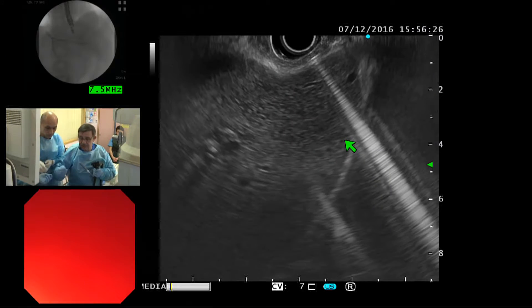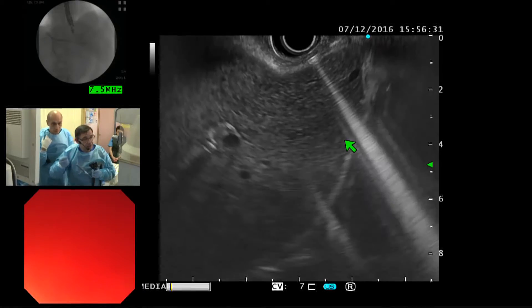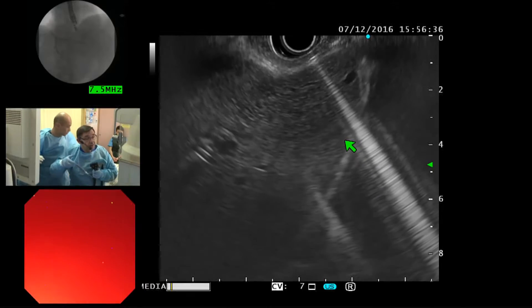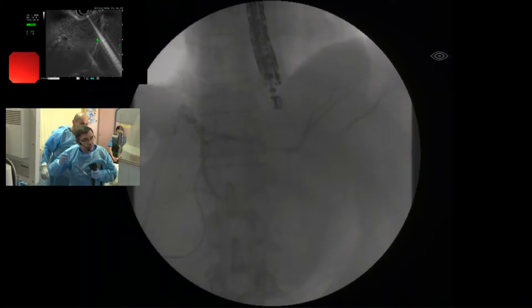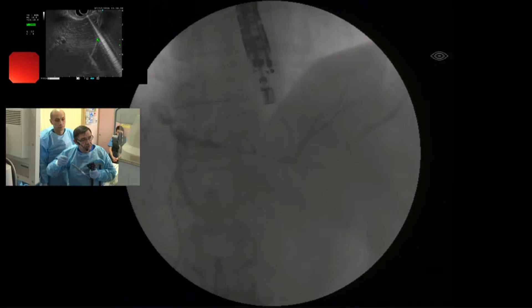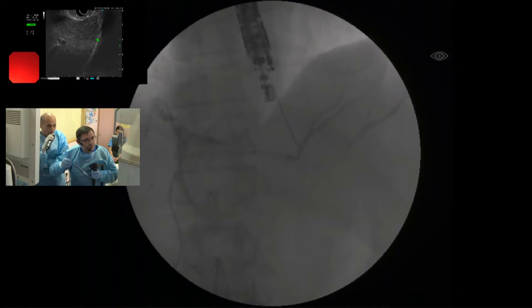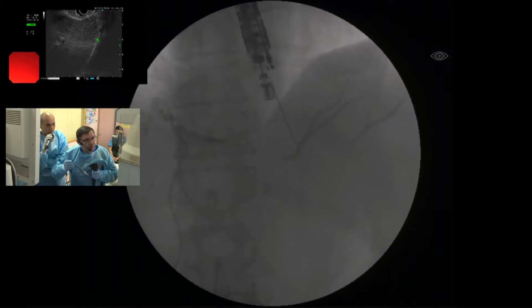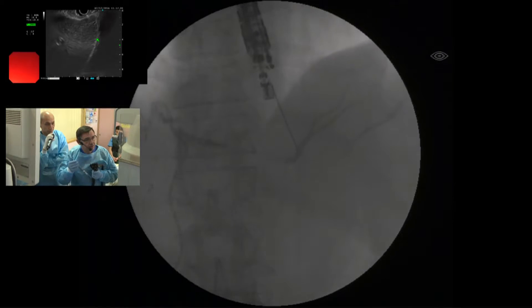Give me the wire, please. Maybe an angulated wire will be better, but I will try like this. This is the most difficult part. Usually the puncture is the initial access, but passage of the wire is the most difficult — I'm probably out of the duct.